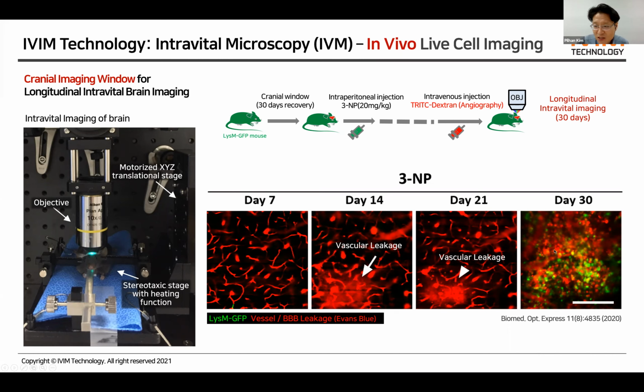Later, it induced a huge inflammatory response with many infiltrating GFP cells at this site. So again, intravital microscopy with the cranial imaging window is a very useful technique to observe a certain part of the brain for a very long time in a repetitive manner.